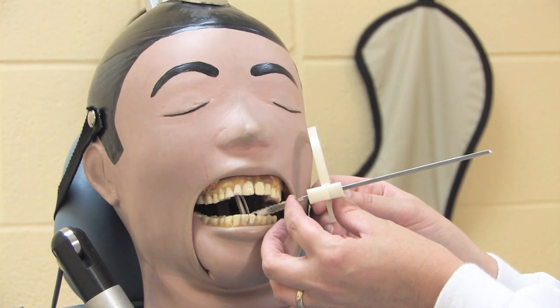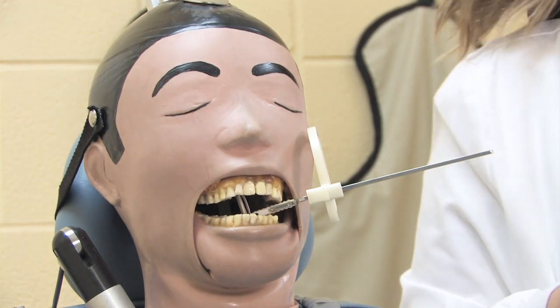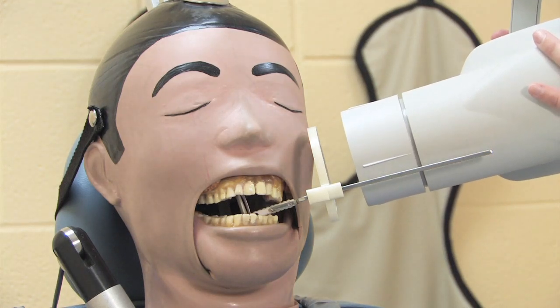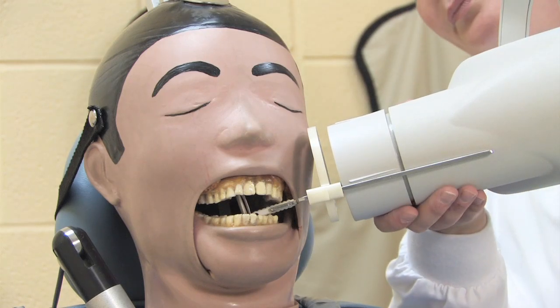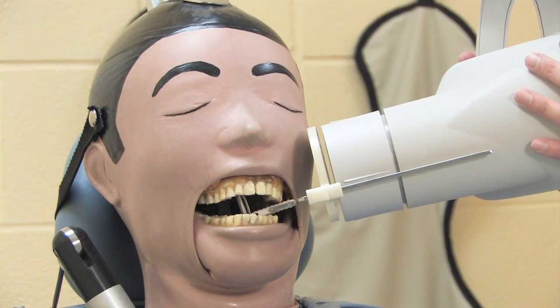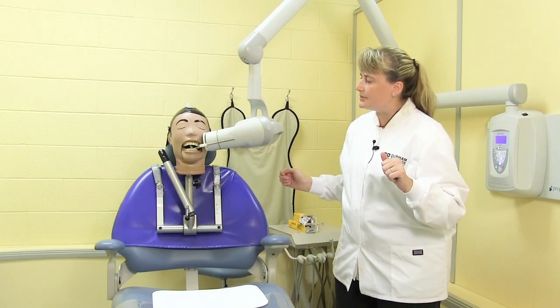The ring is brought close to skin surface but not touching. And the tube head and PID are brought in flush with the ring so that we have the correct horizontal and vertical angulation. I would then exit the room to expose this film.